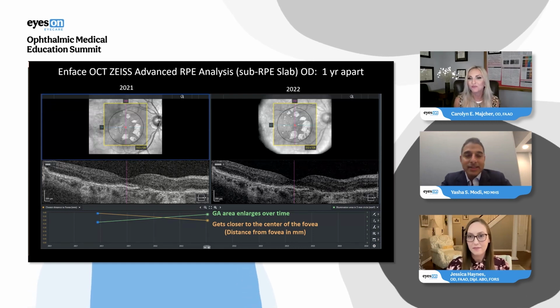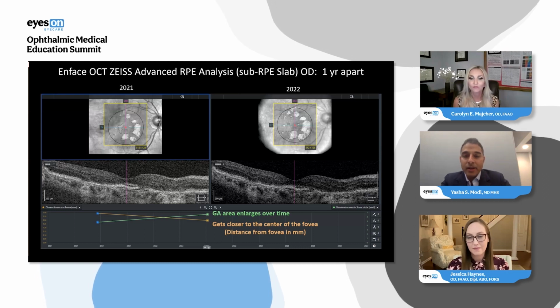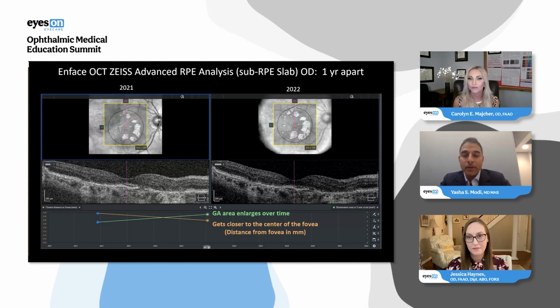I think that's it, right? That's probably going to be the only sign that we have to show patients. So really having quantitative data, where we're so accustomed to qualitative approaches in OCT, is going to be really critical to try and get patients to buy into treatment for geographic atrophy.